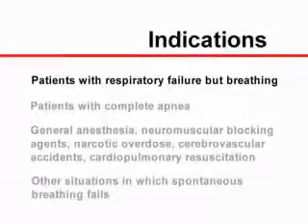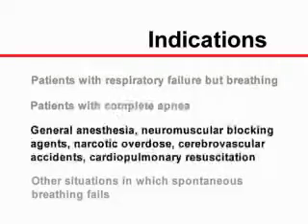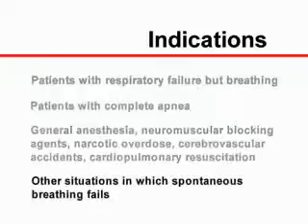Face mask ventilation is used in patients with respiratory failure but who are still spontaneously breathing and patients with complete apnea. Face mask ventilation can be indicated after the induction of general anesthesia, the administration of neuromuscular blocking agents, narcotic overdose, cerebrovascular accidents, cardiopulmonary resuscitation, and other situations in which spontaneous breathing is failing or completely ceases.